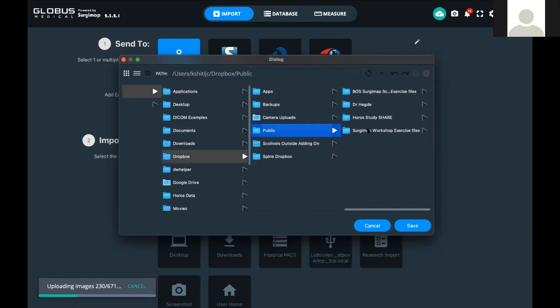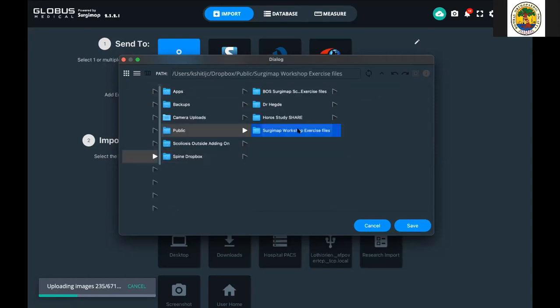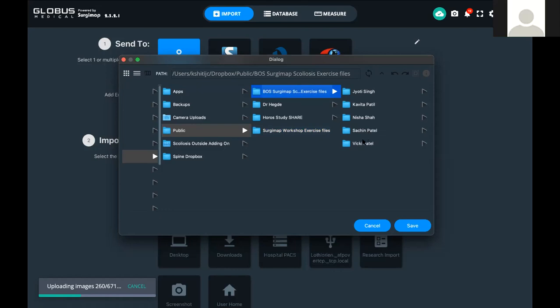I think, so, I'll find some way out there. Just try, or at least for now, take individual images and import. That's fine. Right, Vicky Patel, you can import individual images. Okay. So you are doing it like this, right? The way I'm showing you. Yes, that's right. And then you click on this and then say save. Correct? That's what you are doing.